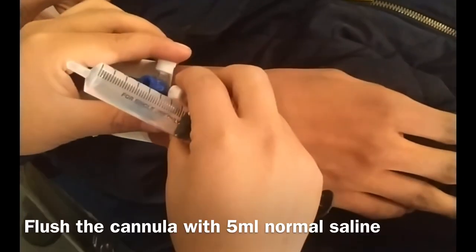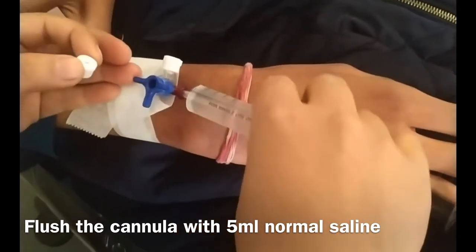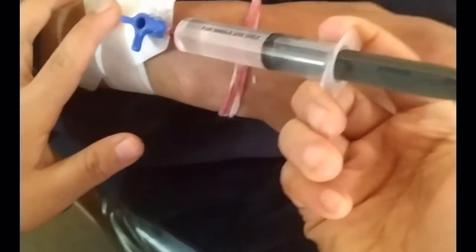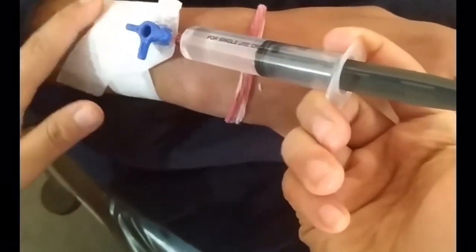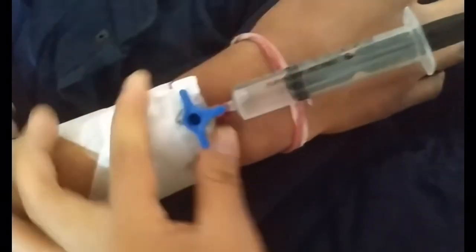To check whether it has gone properly into the vein, flush the cannula with 5 ml of normal saline. The saline flushes properly without any pain, disturbances, or swelling — that means the flow is perfect. Now change the direction of the valve to close the cannula.